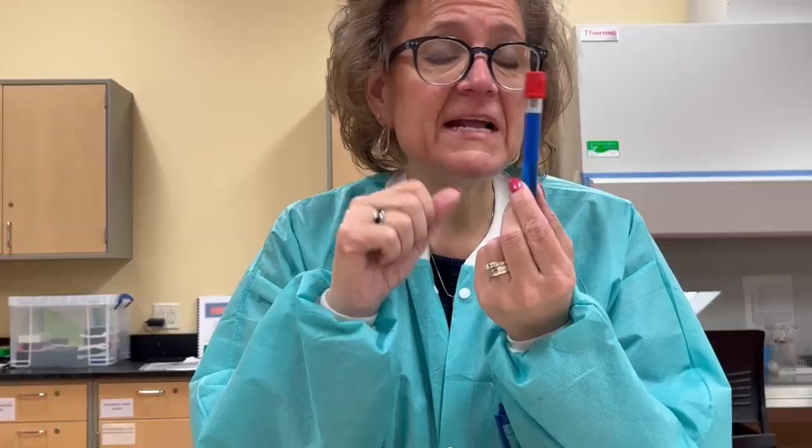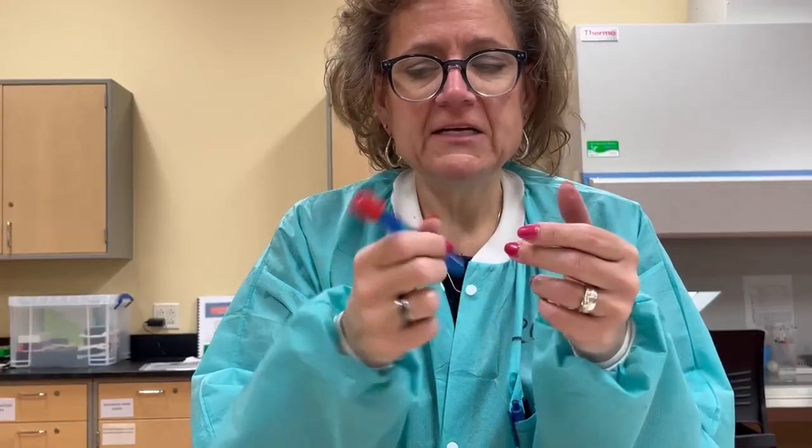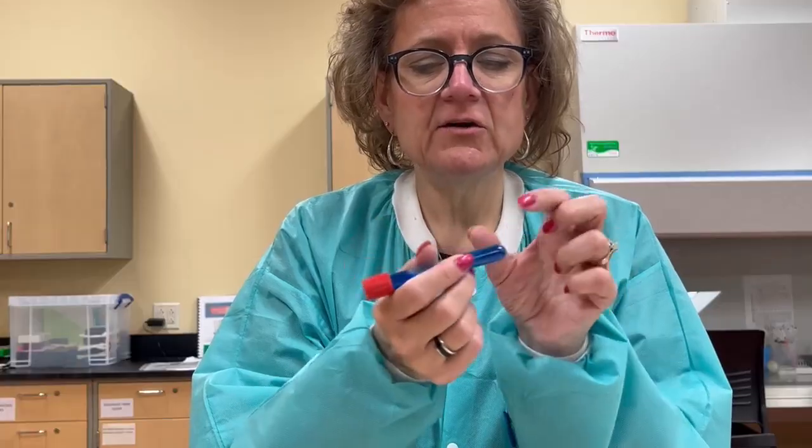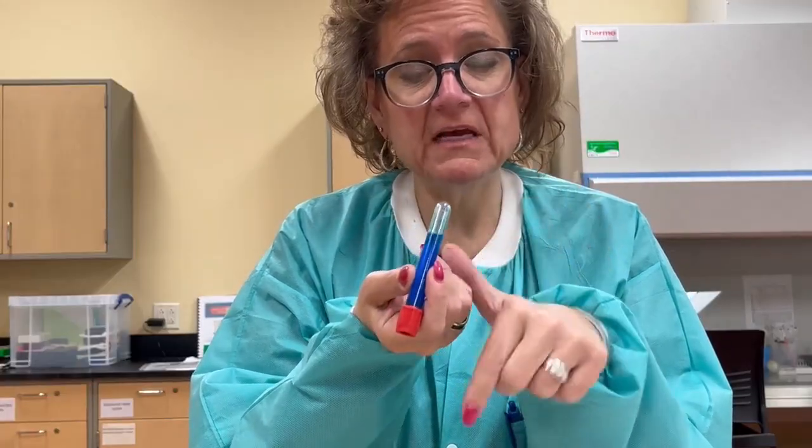You need to have five to eight complete inversions per tube. So there's one, two. If I just do this like this, you can note this much of the blood at the bottom isn't even mixing in, so it's really important to give it that time.